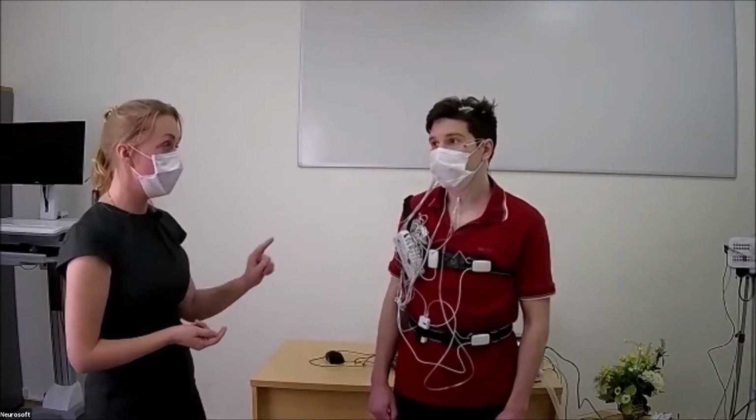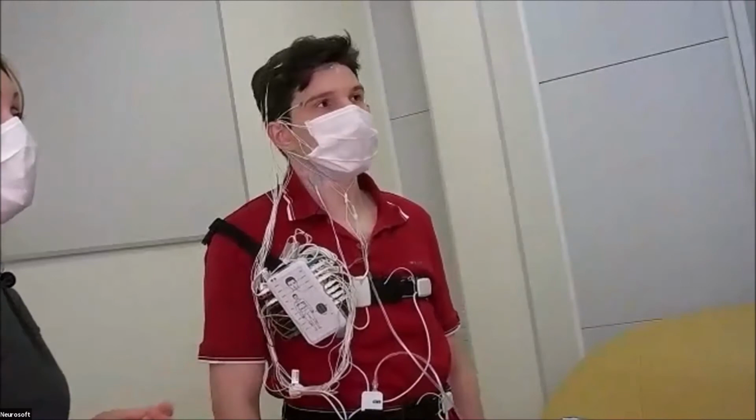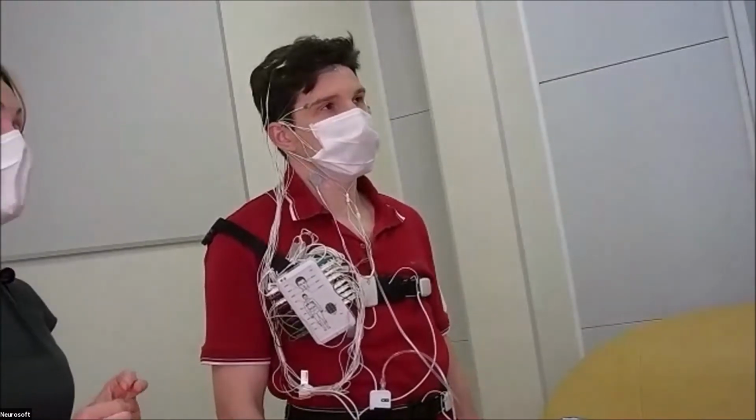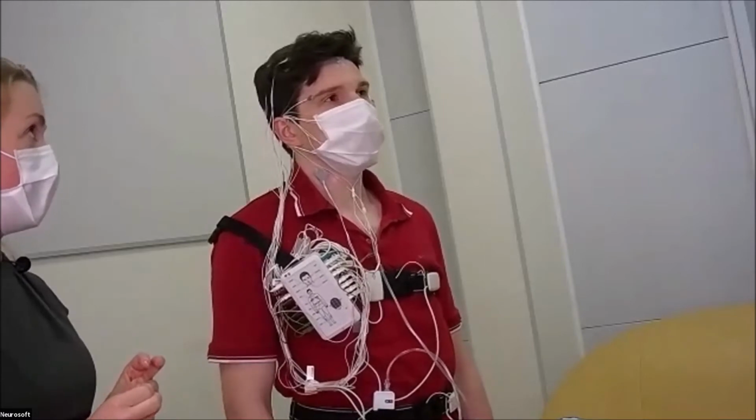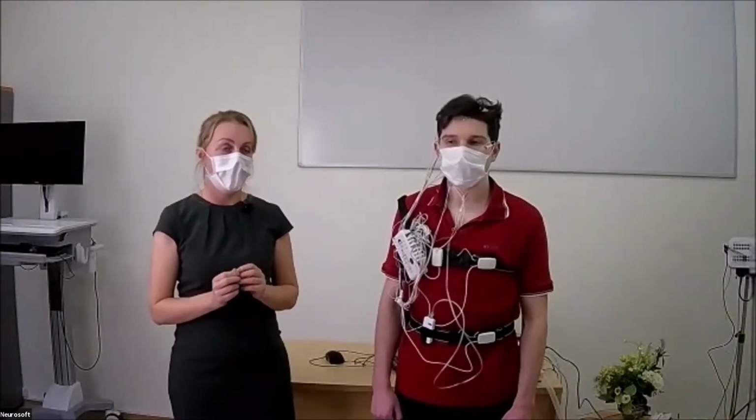So we have 2 active electrodes. The reference electrode we put on the right mastoid.